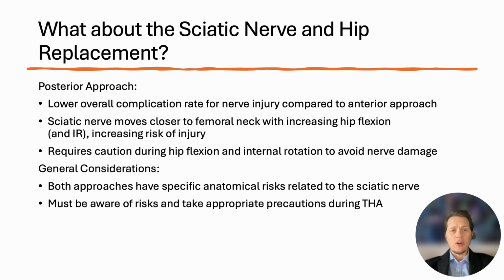So this was a very interesting case. I wanted to present it because it has very classic findings and really good, so to speak, denervation findings that were very prominent, and I was happy to show it to one of my students here and wanted to present it here.